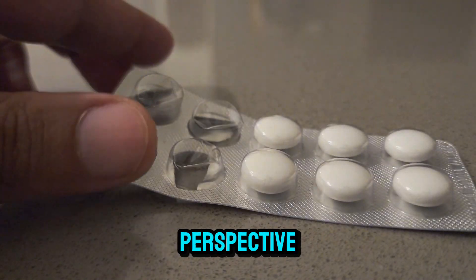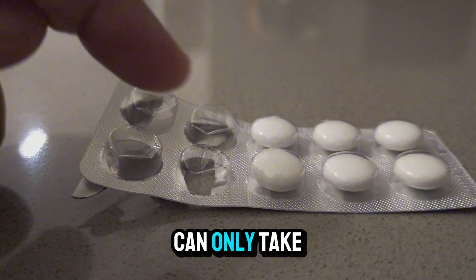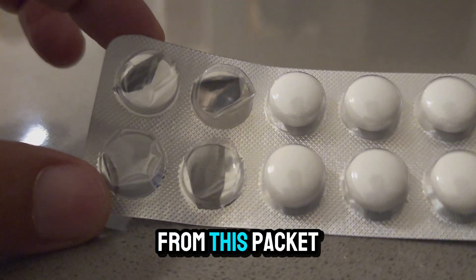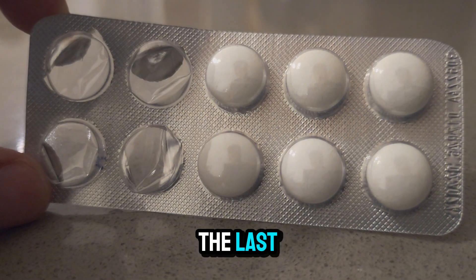To put it in another perspective: imagine you are prescribed ten tablets, but the company tells you that you can only take eight out, while the remaining two will not come out from the packet and you should throw them away. How comfortable would you be to throw away the last two tablets?